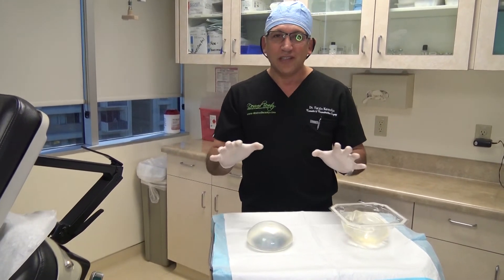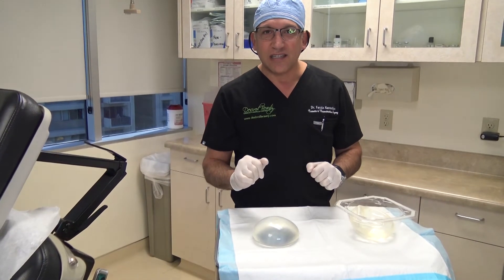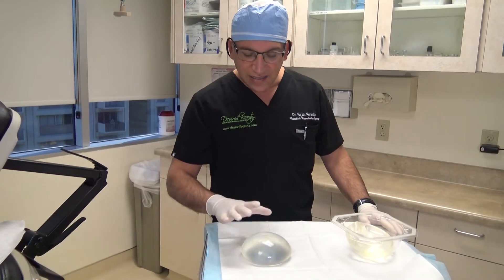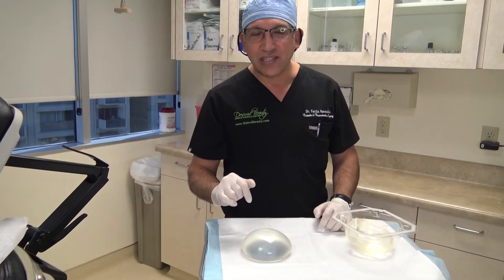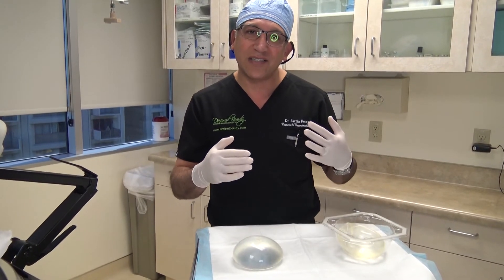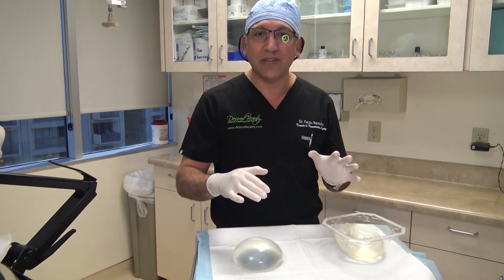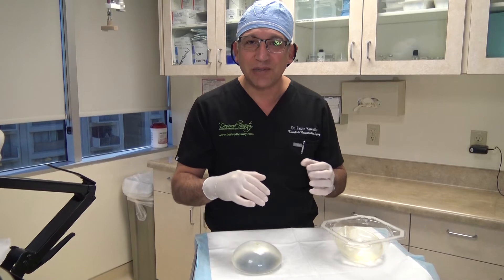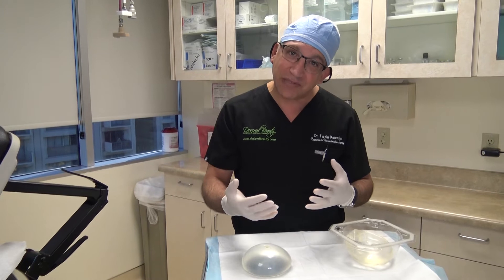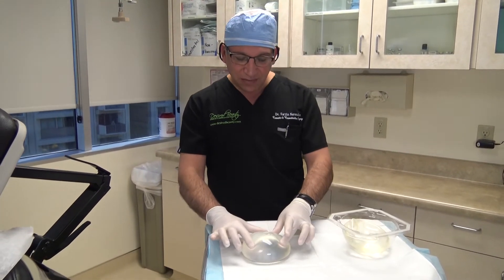I wanted to go over one of the issues that a lot of patients find very interesting. Today we removed this saline implant from a patient who was complaining that one implant had gone down, but it had stopped — so she didn't think it was deflated. I was explaining to her that's one of the ways a leaking saline implant presents itself.